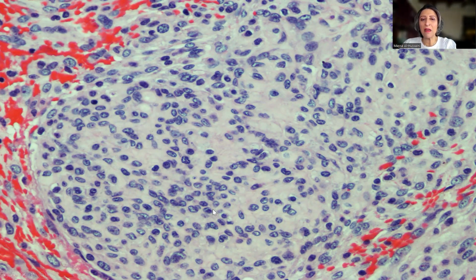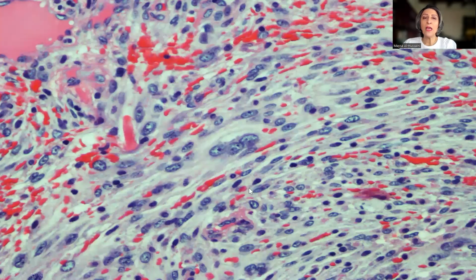Perhaps some tendency or something similar to whirling pattern, but it's not really very well clear. Neither are really intranuclear inclusions, but this syncytial growth pattern should be really very helpful. Now remember that atypia in meningioma is not important. So pleomorphism is not one of the features that we look for while we sign out cases of meningioma when we want to assign the grade.